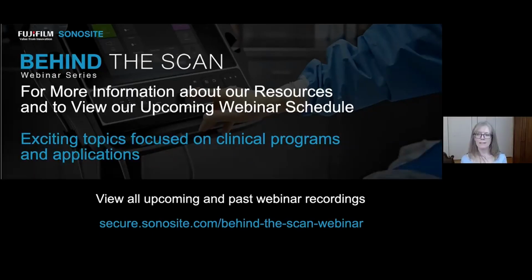I see one of the people who's asking about the guide has the Sonosite Edge. If you have the Sonosite Edge, then you have to go to page 2 of the soft keys. So when you're looking at the monitor, underneath there will be a list of tabs. The far right tab says page 1 of 2. You're going to push it and get to page 2 of 2, and then you'll see the button for center line, and you can turn the center line on that way. Thank goodness for you, Kristen. Thanks.